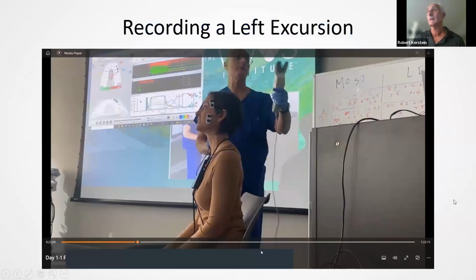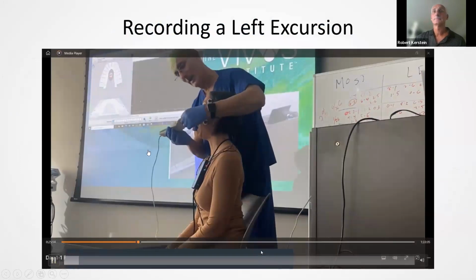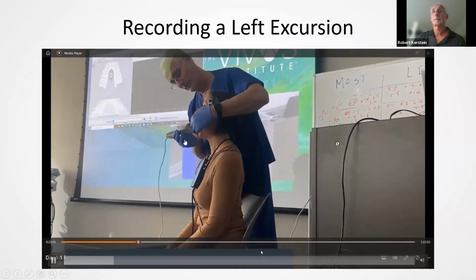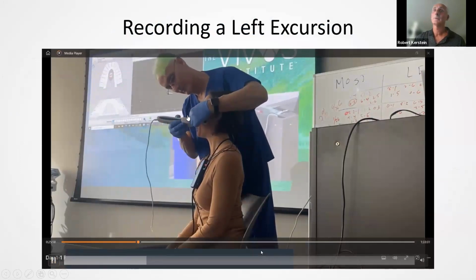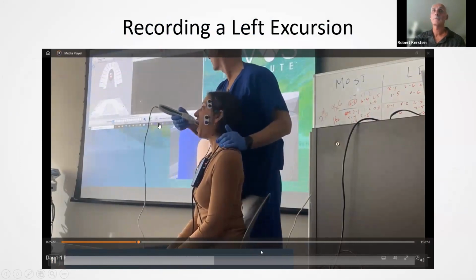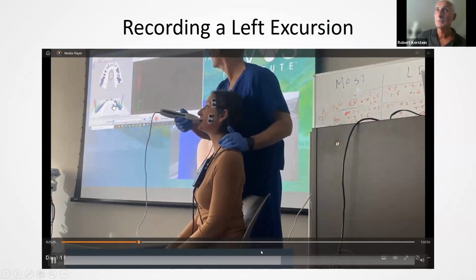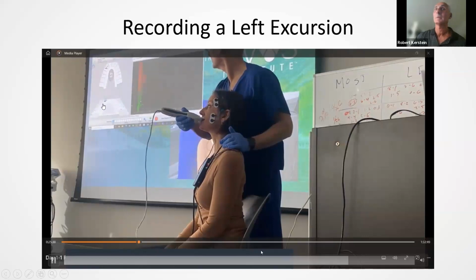Now let's look at the left one. Now with the left one, this time watch the sequence of events again. I'm putting it back in her mouth. Watch how I turn around. I look up at the screen. Then I hit the button. Now I tell her what to do. And now I tell her to go left because I saw the data come up and stabilize.